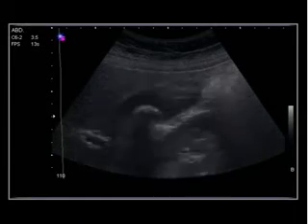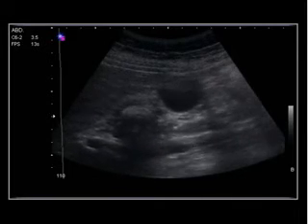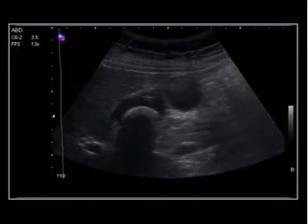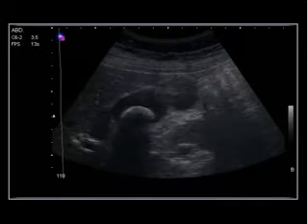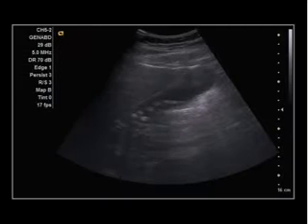So looking at this video, we see a large echogenic stone with posterior shadowing. In this case, the patient had simply biliary colic. This would not be a stone you would miss. Now these are smaller stones, but still easily identifiable. As you look in the lumen of the gallbladder, we see echogenic structures with acoustic shadowing that emanates just posterior to it. This is another example of the same finding.